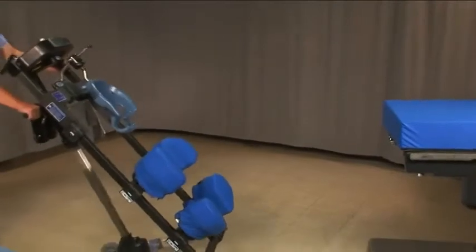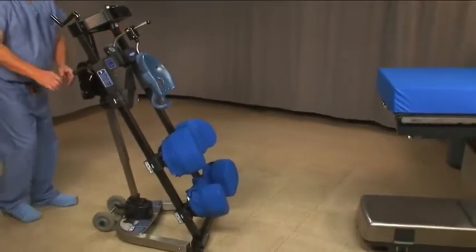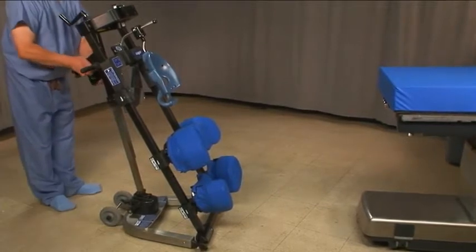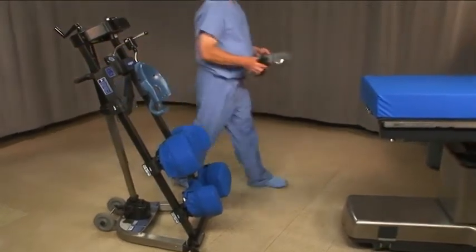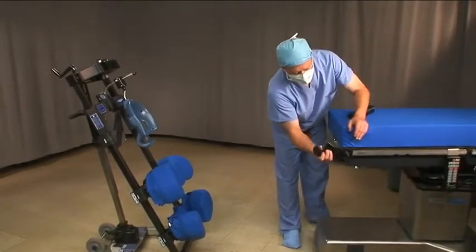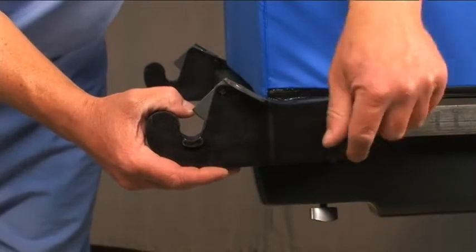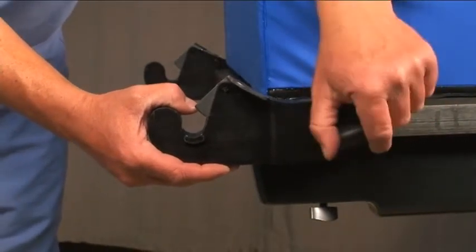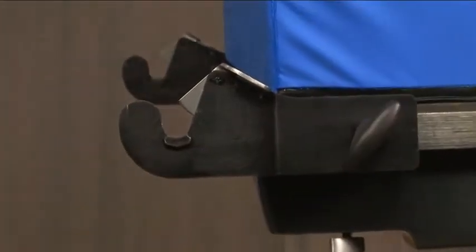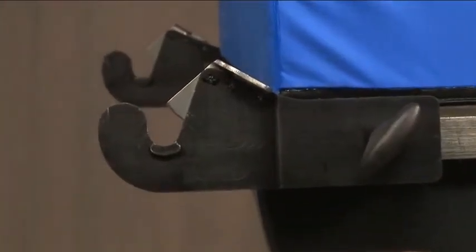Position the FlexFrame so that it is about 4 feet or 1 meter from the end of the table. Remove the clamps from the handlebars of the frame and slide them onto the rails of the table. The clamps should protrude past the end of the table about 4 inches or 100 millimeters. Make sure that the clamps are even and that they are seated properly on the rails before tightening.